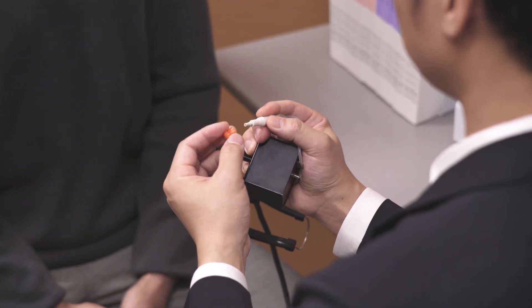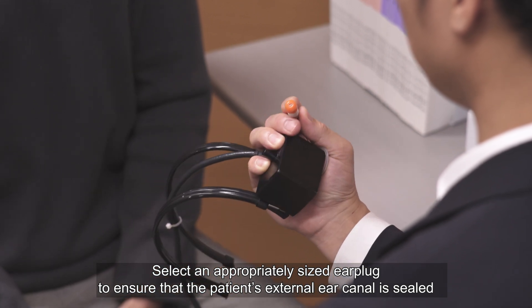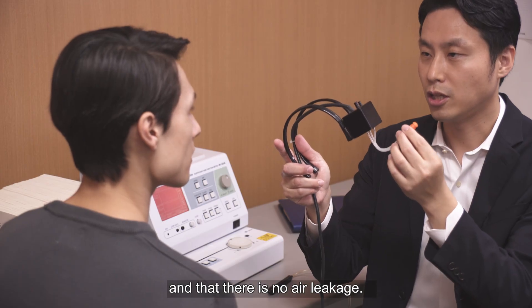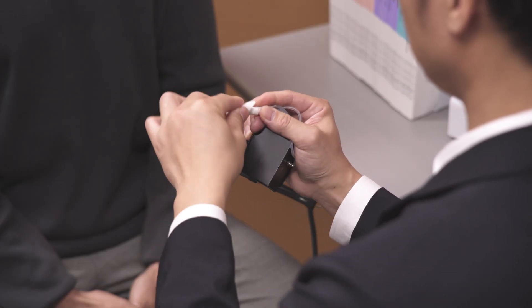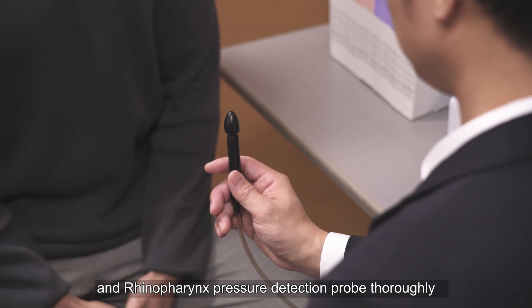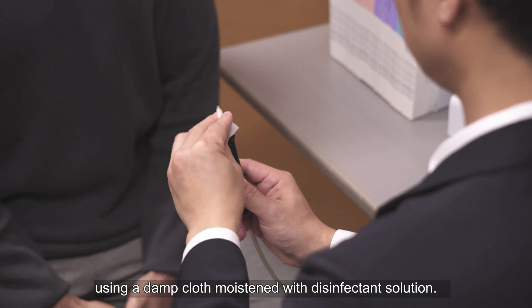Before conducting the test, select an appropriately sized earplug to ensure that the patient's ear canal is sealed and that there is no air leakage. Clean the TTAG probe and rhinopharynx pressure detection probe thoroughly using a damp cloth moistened with disinfectant solution.